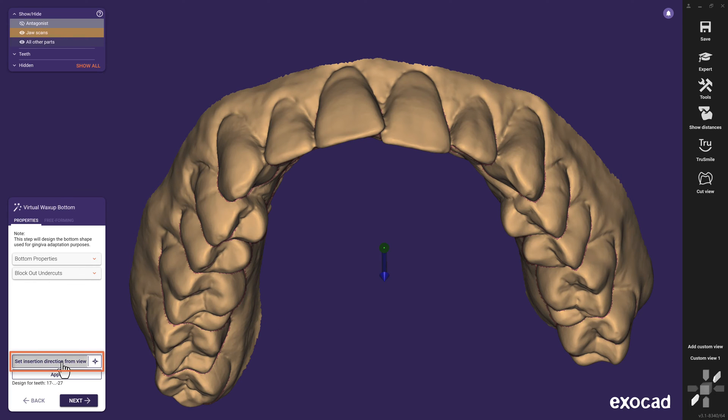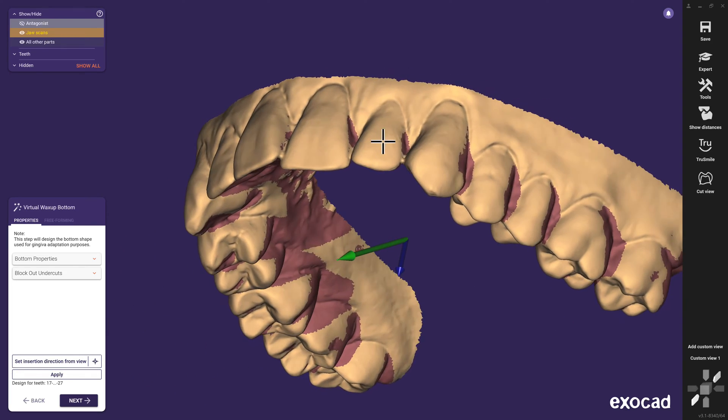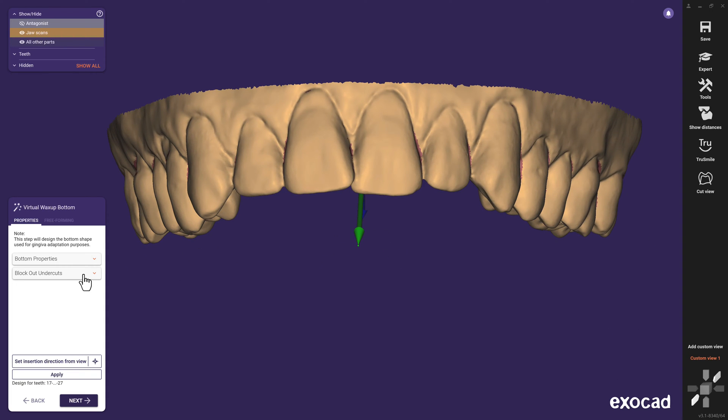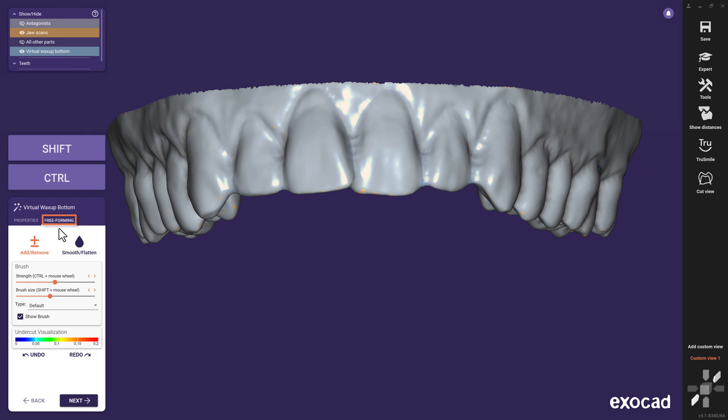With a click, we set the insertion from view to evaluate if the undercuts highlighted in red would be enough to hold the mockup in place. For now, we apply the default parameters to generate a virtual wax-up bottom to continue, and later I will explain all the parameters in detail. If desired, you can make use of the free-forming tab. By removing blocked-out material, you ensure the best possible fit.